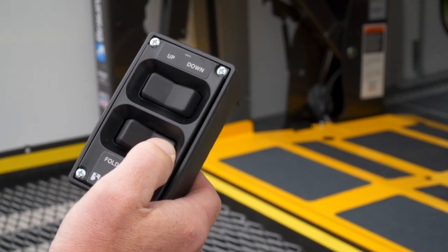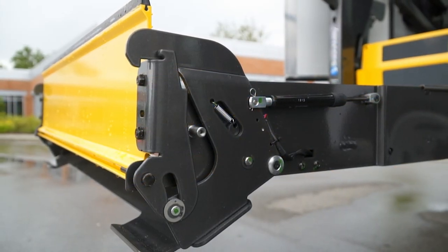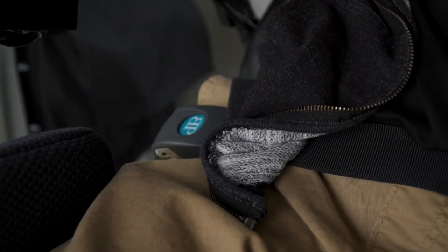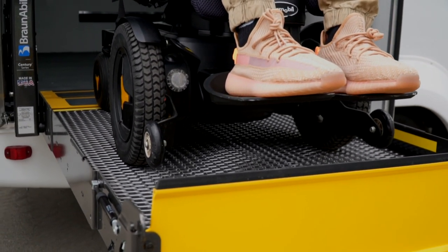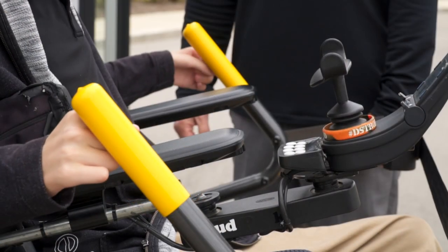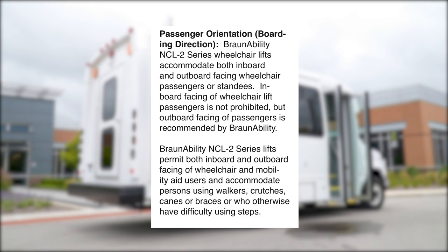Once the platform is fully deployed, be sure the inner barrier rests solidly on the vehicle floor and check to be sure the outer barrier is fully raised and locked. Also be sure that your passenger's safety restraints are securely fastened and then buckle the handrail belt if equipped. Then guide your passenger onto the platform, being sure to keep the wheelchair between the yellow boundaries. Once fully boarded, engage the wheelchair brakes or turn power off to powered wheelchairs and ask the passenger to hold the handrails if possible. Note that BraunAbility lifts can accommodate passengers who prefer to face inward; however, BraunAbility recommends the outward position because of the enhanced sense of security it provides for passengers.